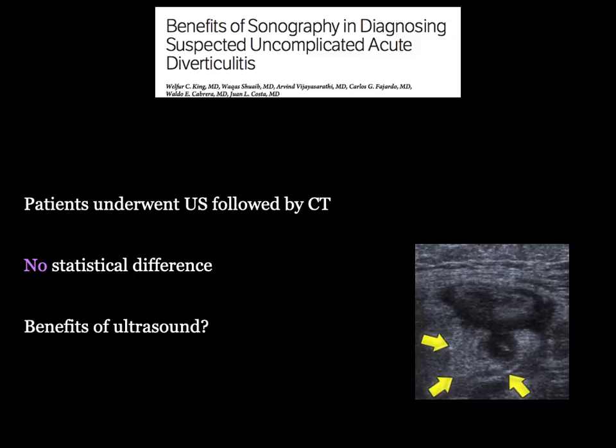And if you think about it, patients with diverticulitis and with kidney stones come in frequently, right, with recurrent symptoms, recurrent kidney stones, recurrent diverticulitis. So they may get many CT scans over the course of their lives. So if there's something that we can do as providers to make the diagnosis without having patients need to undergo radiation exposure, point of care ultrasound is going to be our best bet.